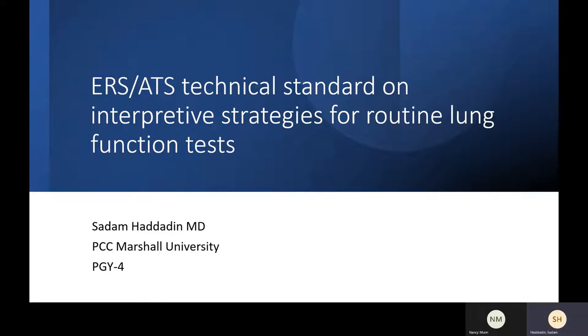Yes. Now when you have the Z-score, you can use it for the lower limit and upper limit, and you use it for the severity instead of using 20%, 30%, or 70%. It's not a big difference, but it's clearer for the standardization of reading the PFT. There's no effect on the predicted value. With the percentile the average is 50, and here zero is also the average.